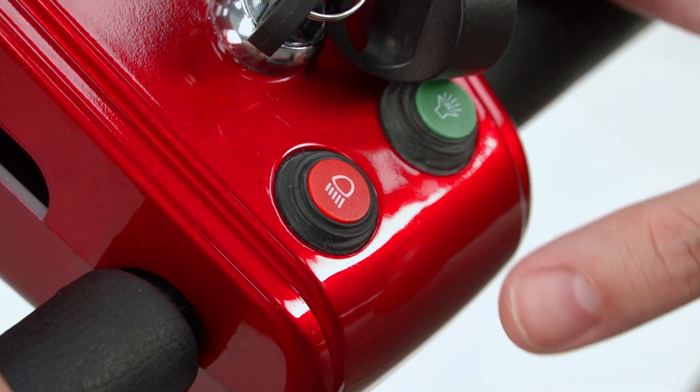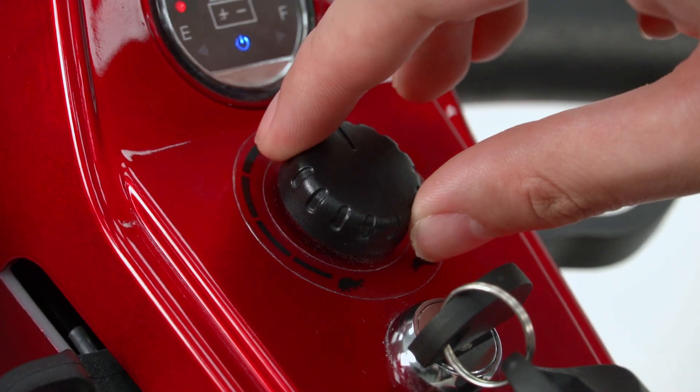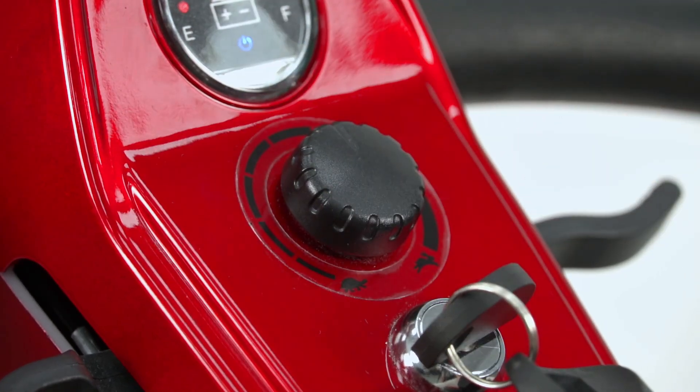Controls: To turn on the headlight, press the headlight button. To turn it off, simply press the button again. The speed can be adjusted by a dial. To increase the speed, turn the dial towards the rabbit symbol. To decrease the speed, turn the dial towards the tortoise symbol.